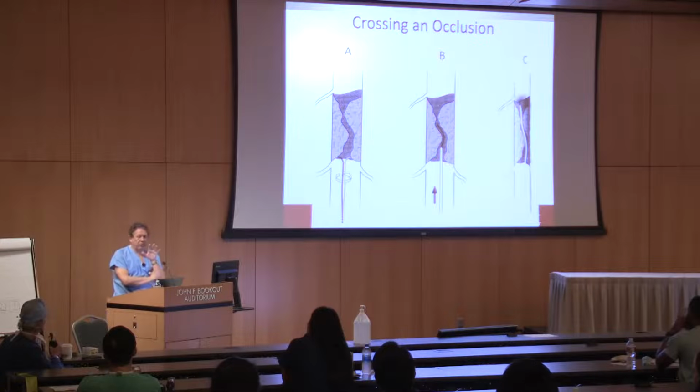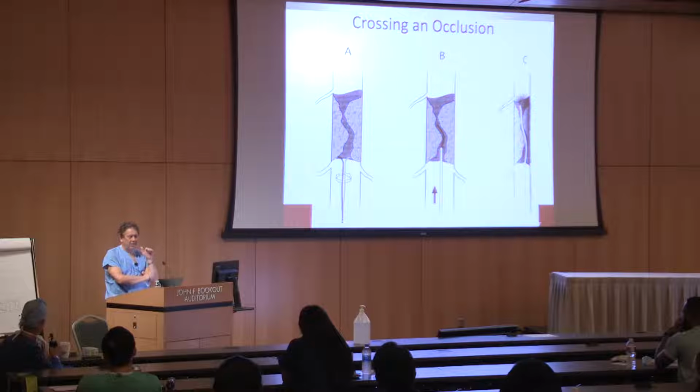And the wire, I always think of Top Gun, with that famous line where he said, never leave your wingman. Your wingman is the wire, okay? The wire is first in and the last thing that really comes out because it really saves you if there's a problem and you've got to actually control this.